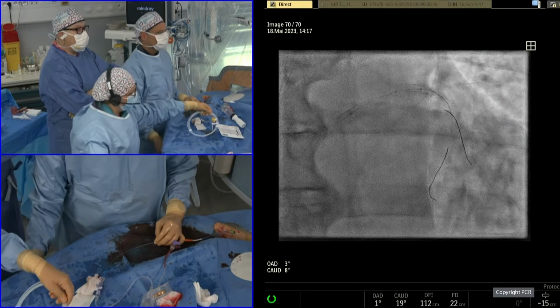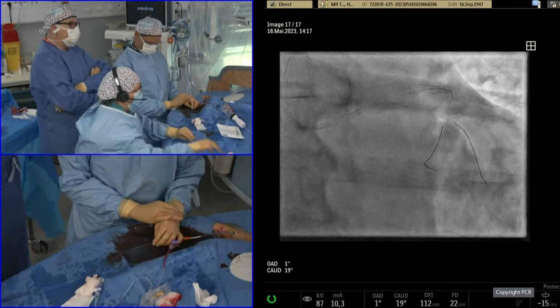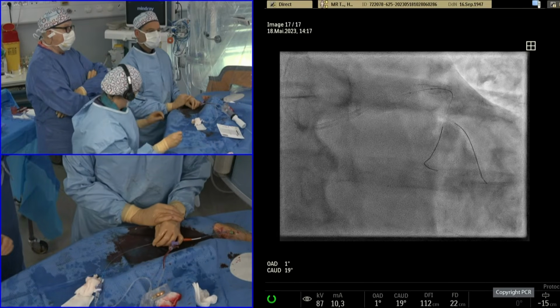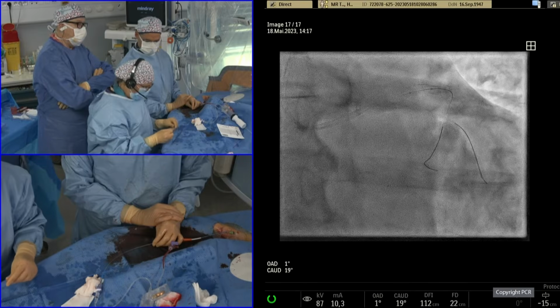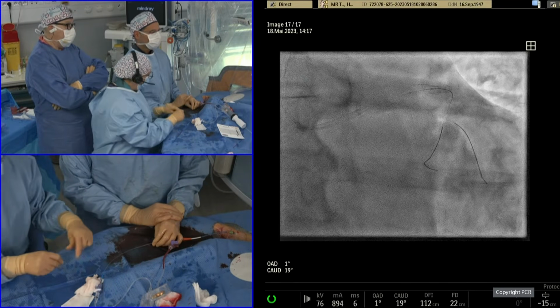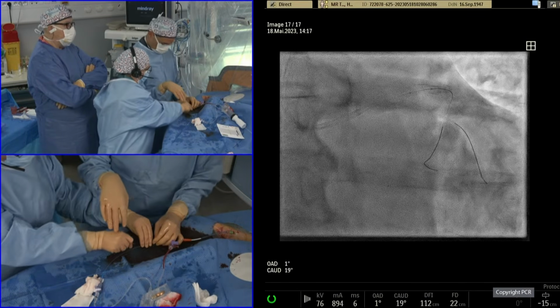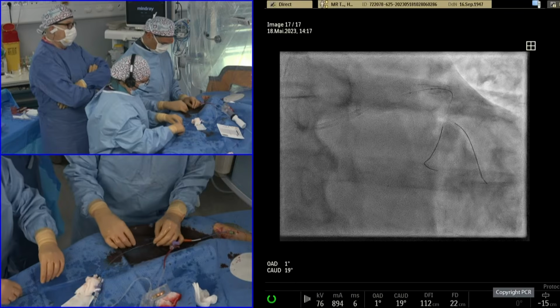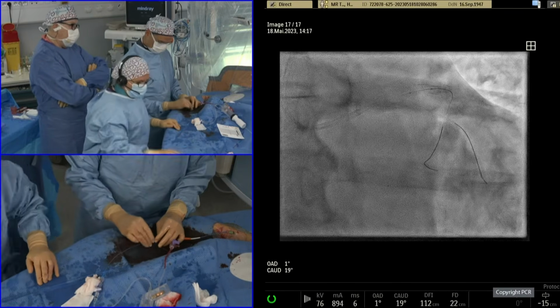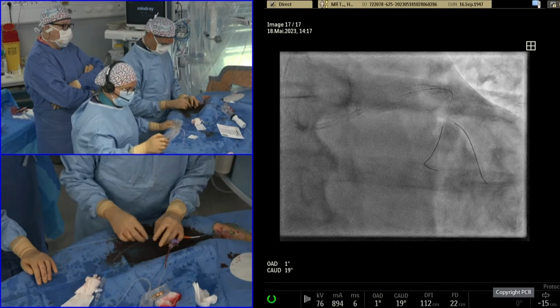I agree with you. This is true, but unfortunately, in the KISS trial, again, it's not the left main lesions. We could not reflect clinical benefit of kissing balloon over POT-side-POT. The trend in terms of periprocedural AMI is going in the other direction. A little bit better outcome with POT-side-POT. I think it's just too early to expect the benefit.